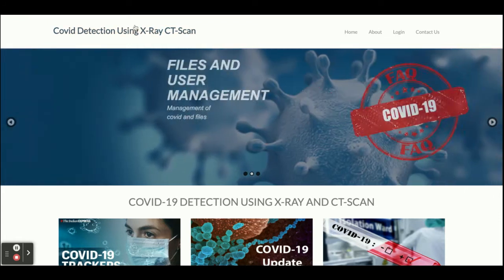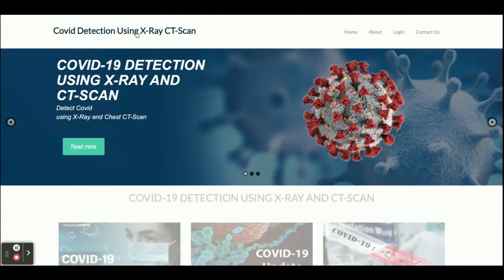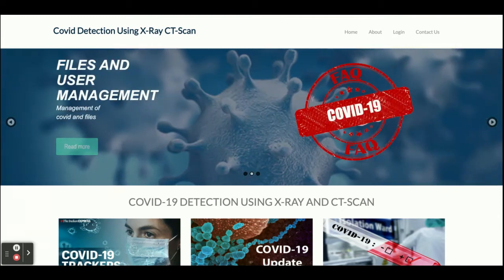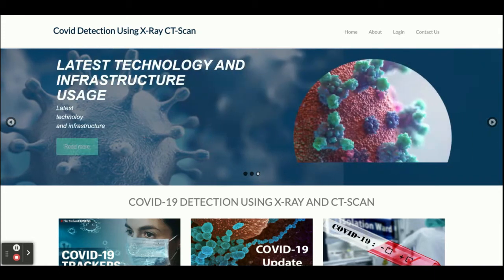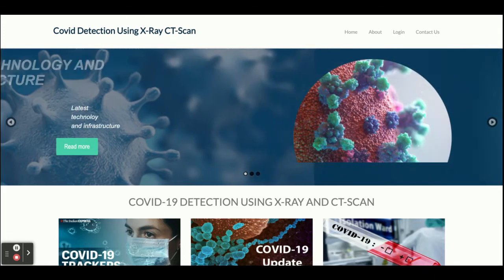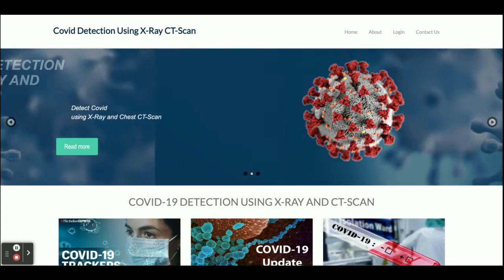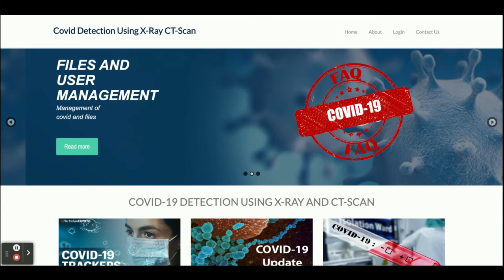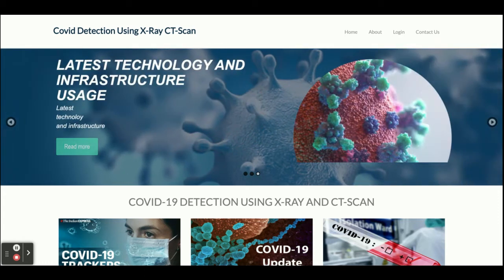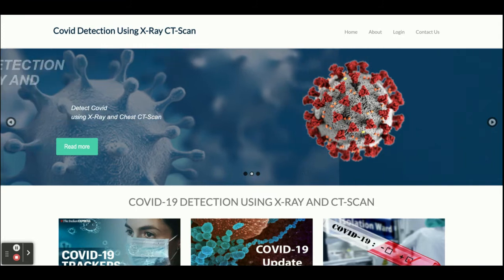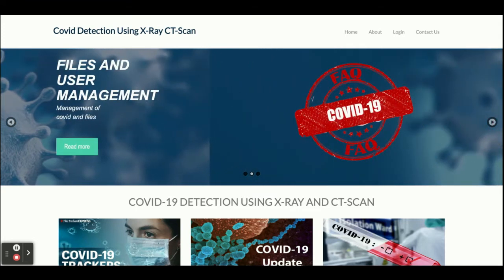Hello friends, welcome again. This is my new project: COVID detection using X-ray and CT scan. This is a machine learning project developed in Python, Django, and MySQL. The Python version I'm using is 3.7, Django version 2, and MySQL version 5.6. For connecting MySQL with Python and Django I'm using the MySQL connector — you can also use PyMySQL for running this project.